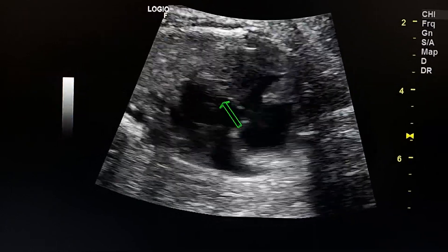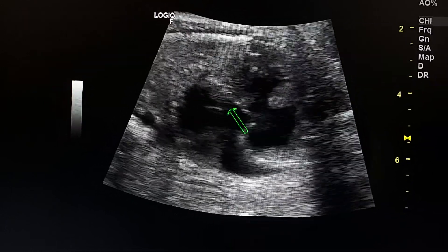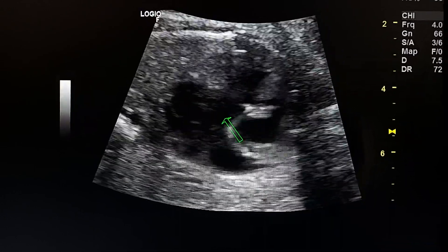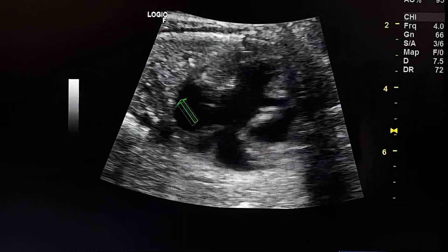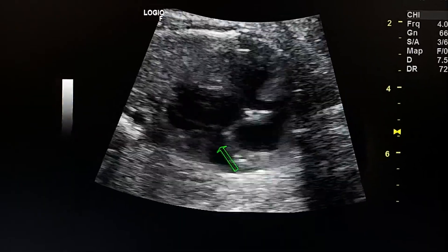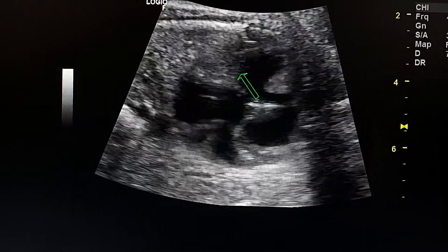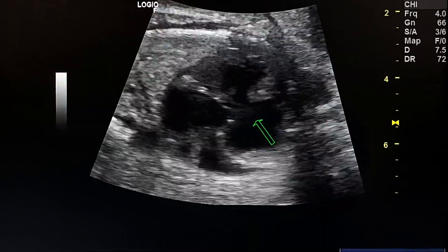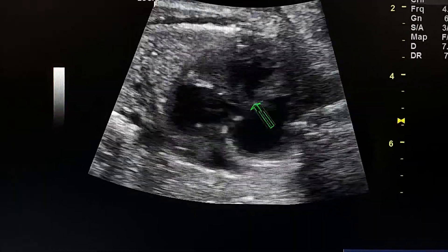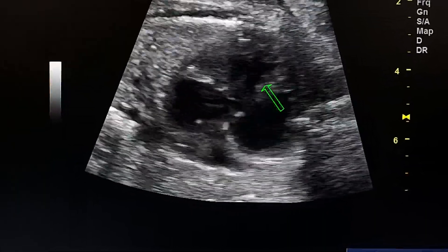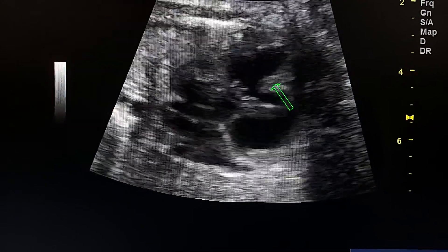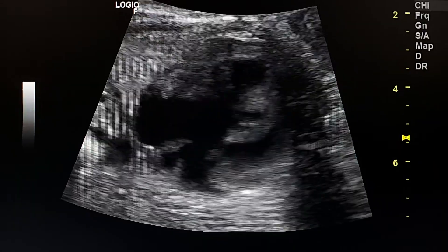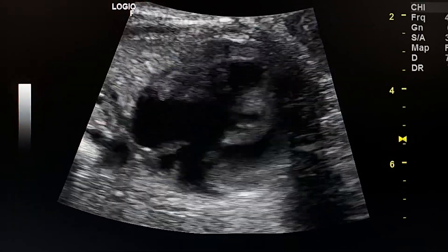This is the mitral valve. This is the ventricle, which is large and thick. This is the left atrium and this is the right atrium. Left ventricle and right ventricle. This is the VSD and the interventricular septum. Tricuspid atresia.